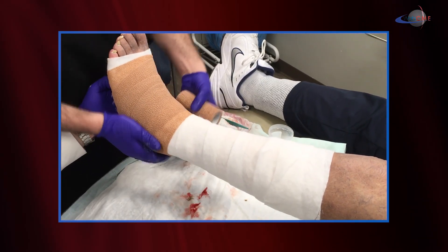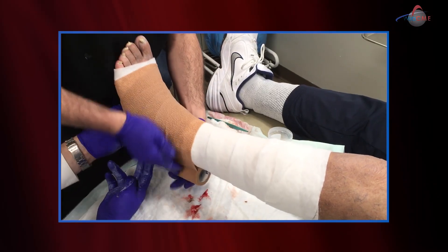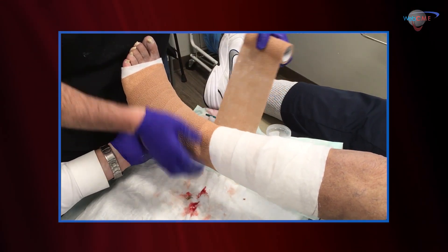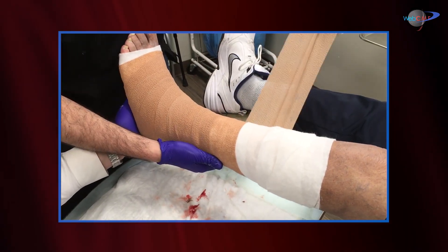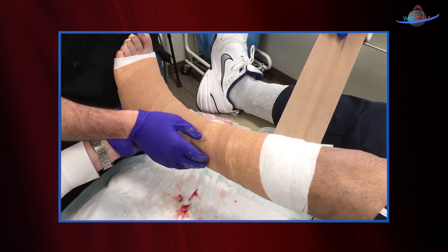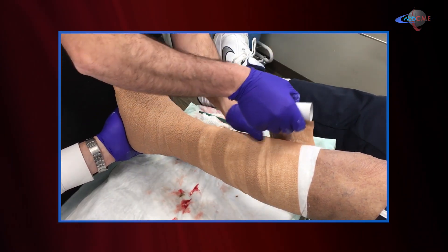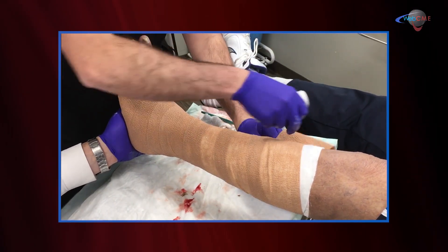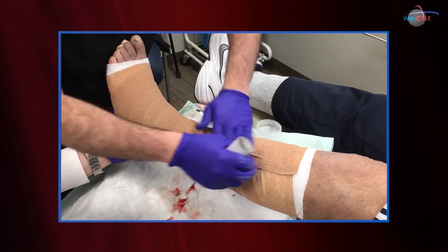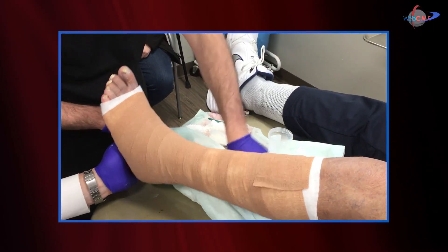We'll inspect the grafts and hopefully have as much success as we did last week with complete healing of those sites. I hope you've enjoyed this edition of the Wound Care Window and this unique application and utilization of cellular and tissue-based products to achieve complete healing in a patient with venous insufficiency non-healing wounds.